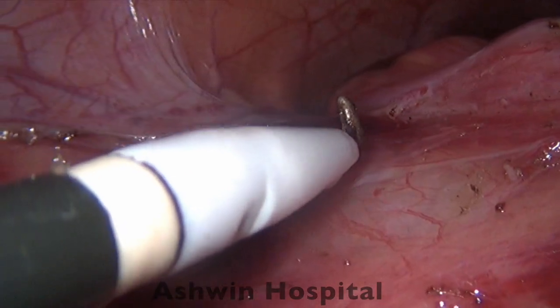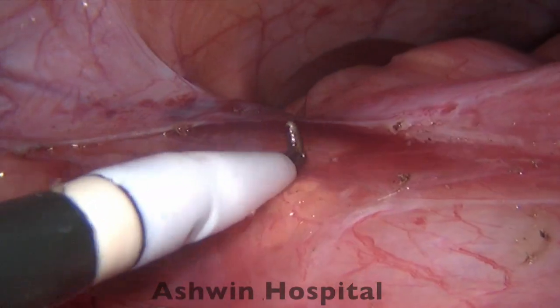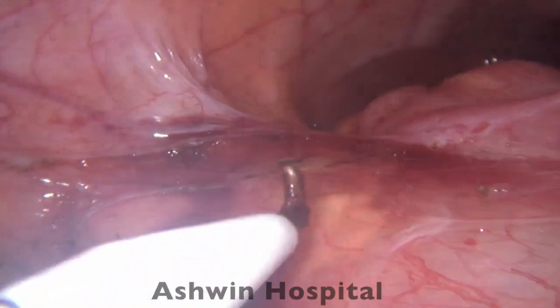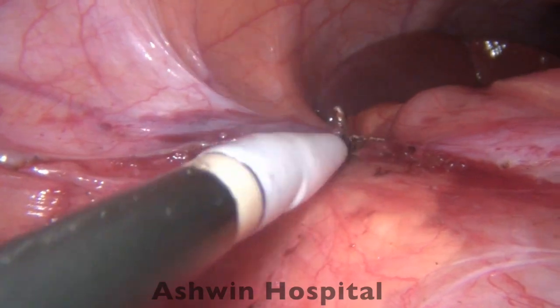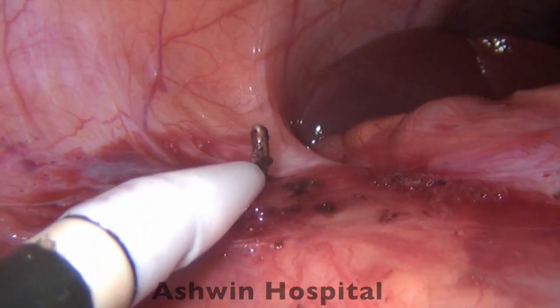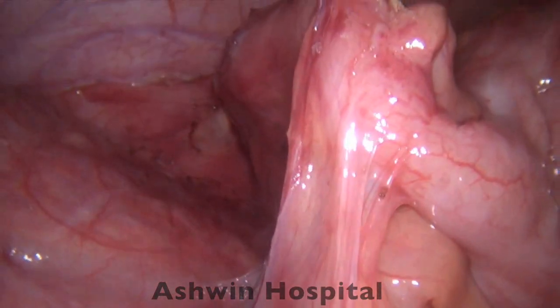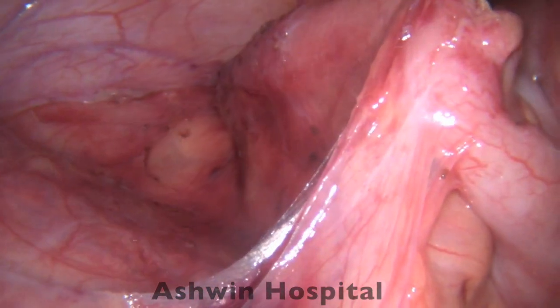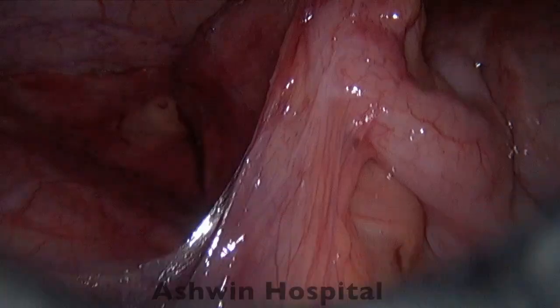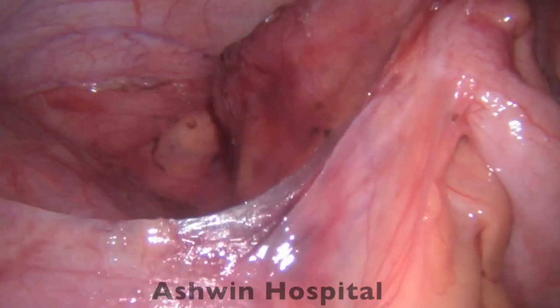All the small thin fascial attachments present — when good traction and counter-traction are given — automatically open up the plane, making identification easy. Whenever there is a small amount of ooze, we use a short burst of monopolar to manage it. We are now able to appreciate the entire length of the appendix, with some small attachments still tethering it close to the base that need to be addressed.